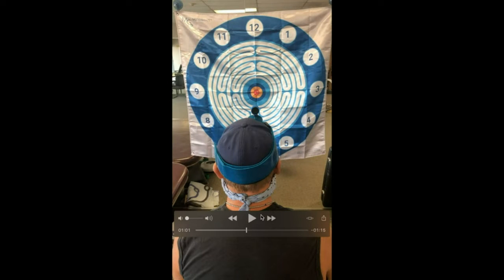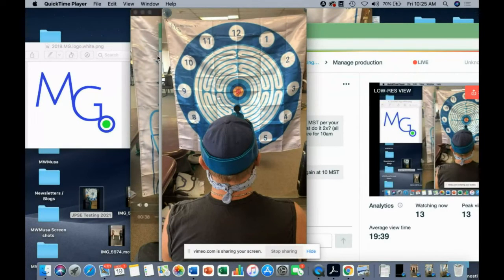He already has a positive for a joint position sense error to right rotation. We'd have to redo for left rotation. You can do extension and you can do flexion. If you're getting more dynamic, which is what I do with my concussion patients later on after they're feeling good, I'll come back and do their quadrant, which is not very research-based, but it kind of follows the same idea of, hey, can I have you look up and to the right and come back down to where you think it is? Can I have you look up and to the left, down and to the left, down and to the right, and make sure that everything is kind of normalized across there. So I'll adapt the standardized testing into more dynamic applications with that.